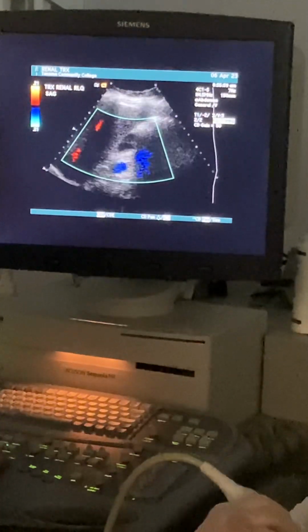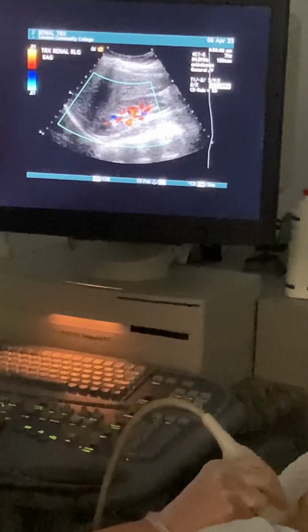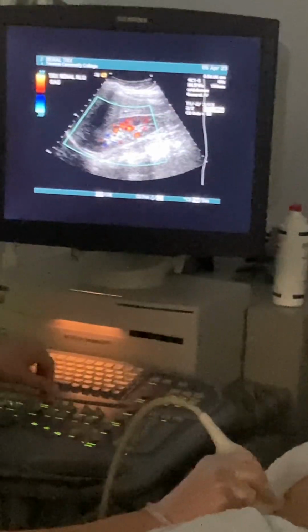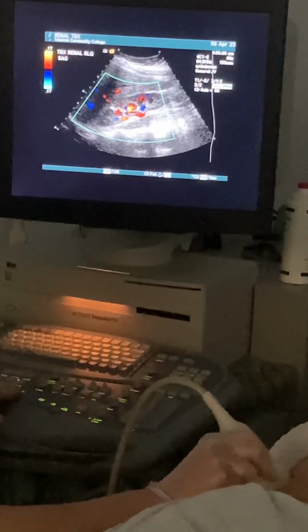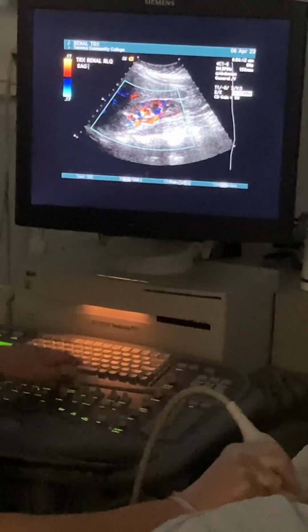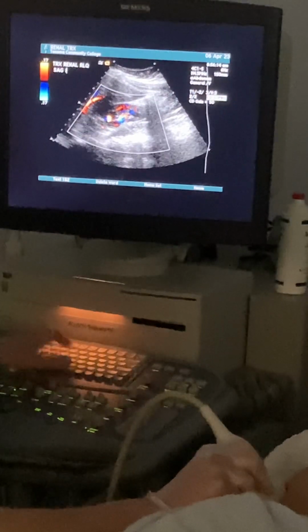Big breath in. And so we'll start with gain up. So we're going to start with this inferior. I'm going to show you guys how we angle correct. So here we go. Go ahead and brace. We're going to do SAG, we're going to do inferior.